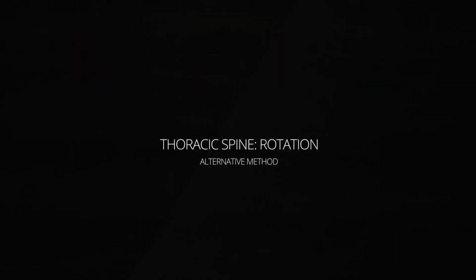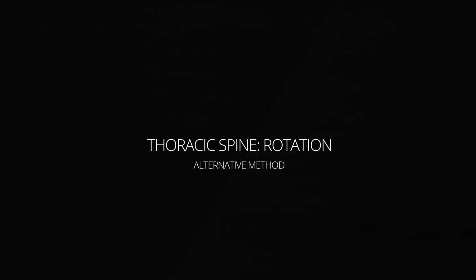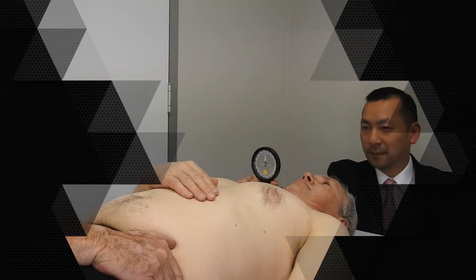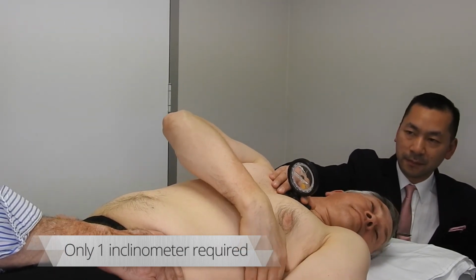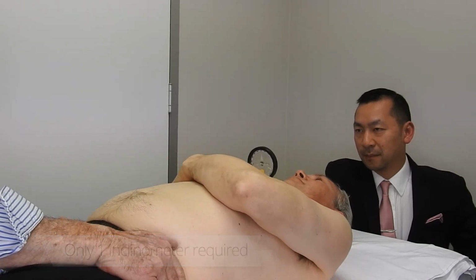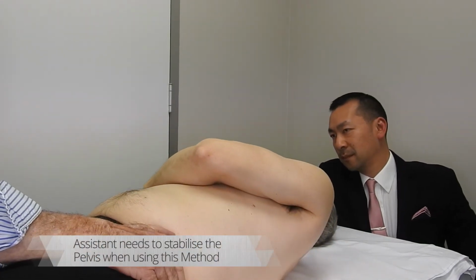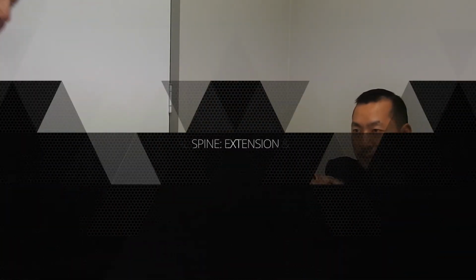Thoracic spine rotation, alternative method. Here, an assistant stabilizes the pelvis, and a single inclinometer is placed on the sternum. This measures the thoracolumbar rotation. Therefore, 5 degrees are subtracted from the total measurement to obtain thoracic rotation.